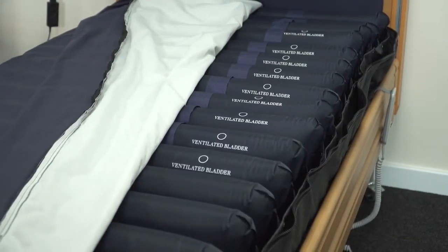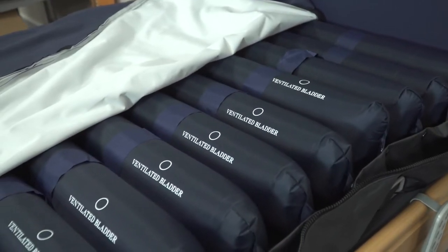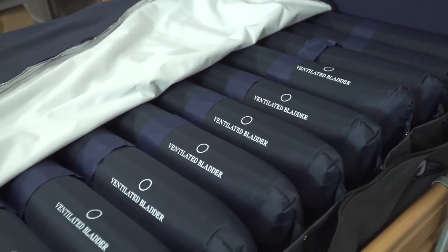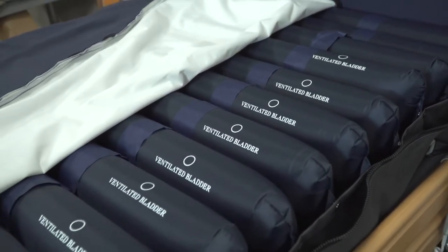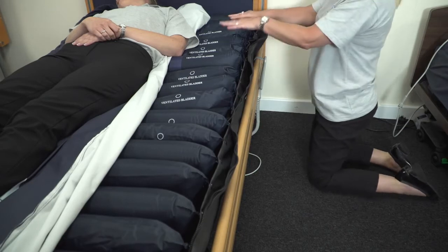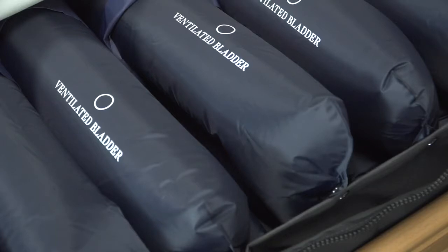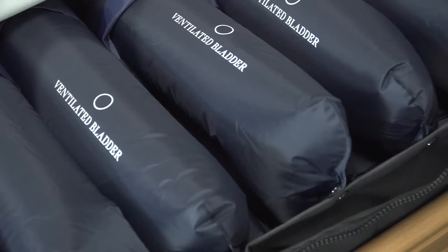We will now look at the dynamics of the mattress. As you can see, part of the cover has been removed for the purpose of this training video. The Ayrshire is constructed of a layer of 14cm wide, 20cm deep cells. The centre cells, which are situated underneath the main body of the patient, are ventilated.